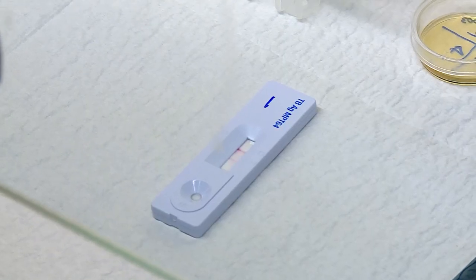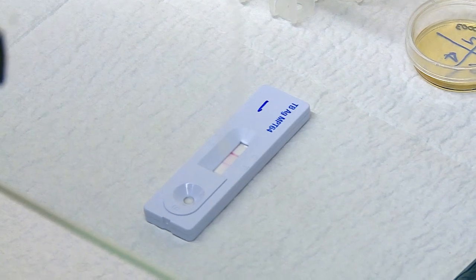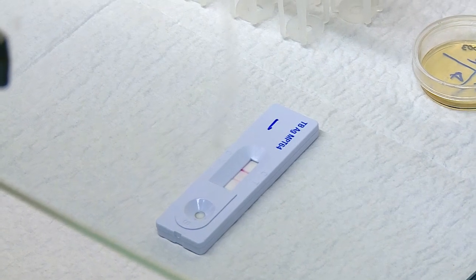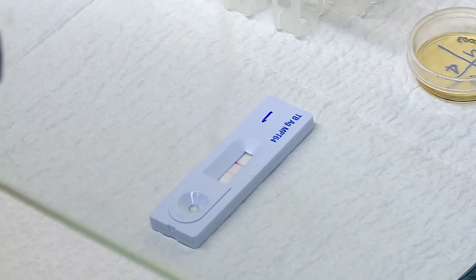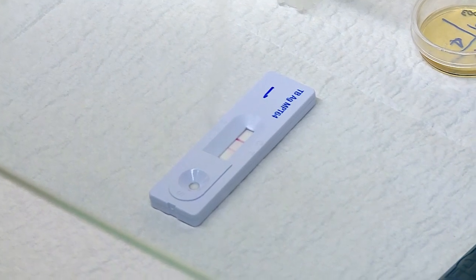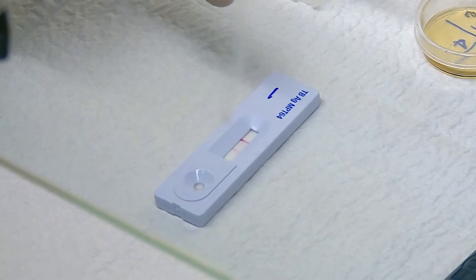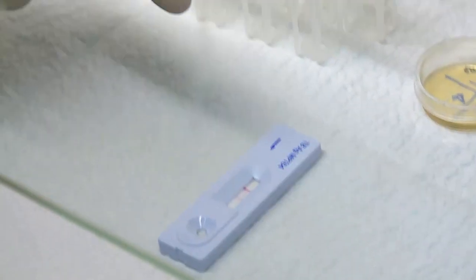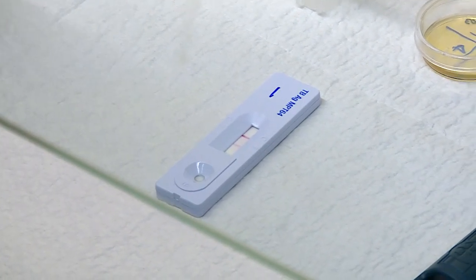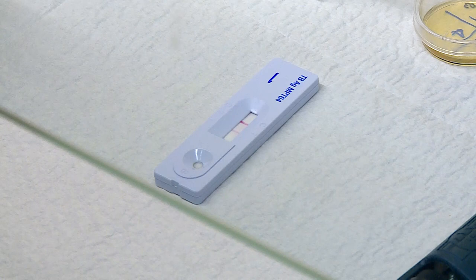We will now see the reaction in the ICT strip. The strip has gold-coated MPT64 antibody. The antigen present in the culture that we placed on the disc moves up by capillary action, and when it comes into contact with the antibody, results in the formation of a colored band in the test area. The inbuilt control has to be positive for the test result to be valid. The test is usually completed within minutes. ICT can be done only for culture and not directly for sputum. A culture is considered positive if both AFB smear and ICT are positive.